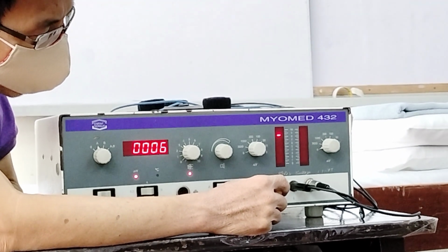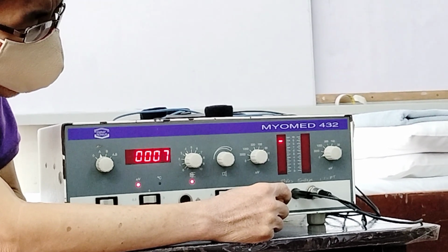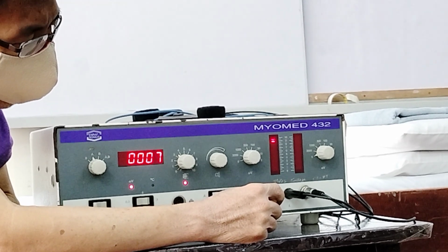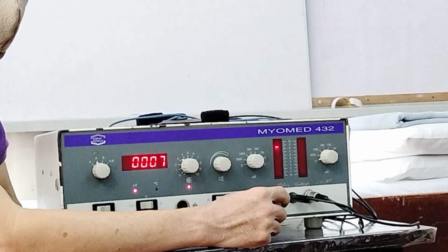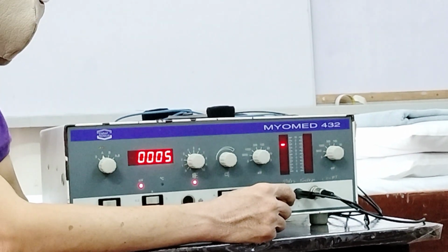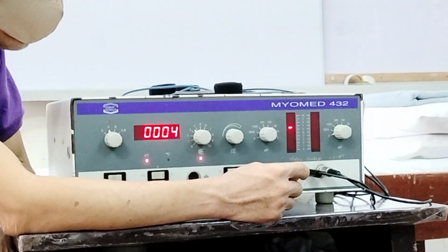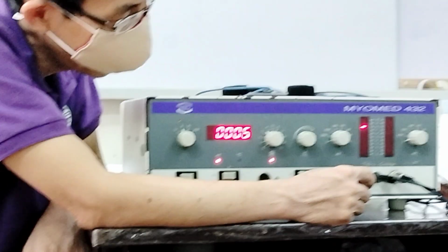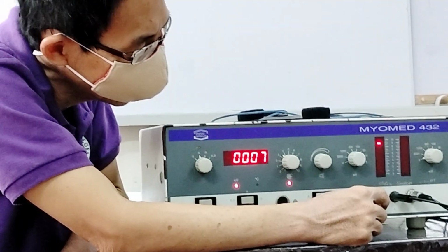So if ever makaya na yun sa patient for 3 times na steady ang bar, we can now further progress that to level 10. So sir, kaya naman ang level 9. Ari na sa level 10, sir ha. Sige, sir. Try to further bend, sir. Contract. Bend, sir. Hapit na ang 10, sir.